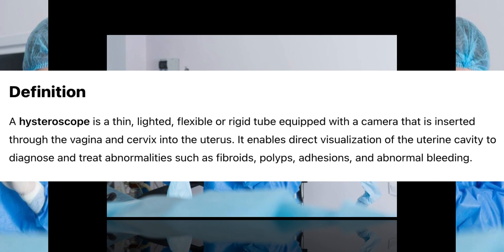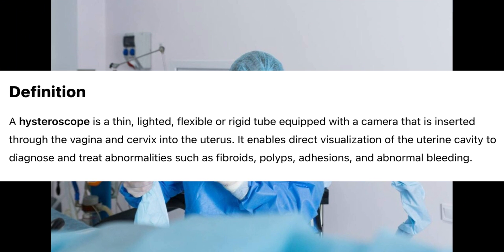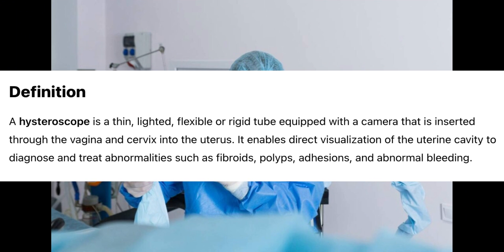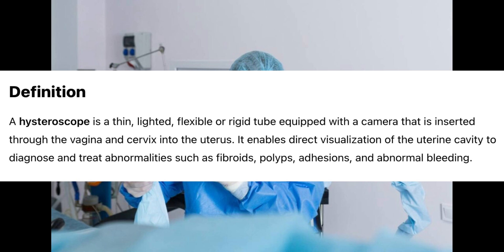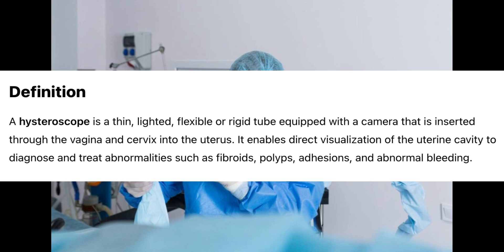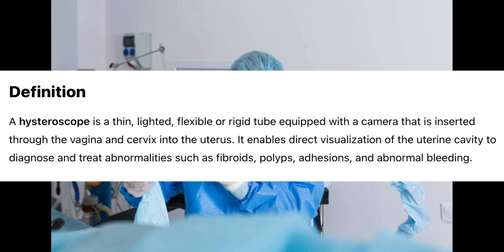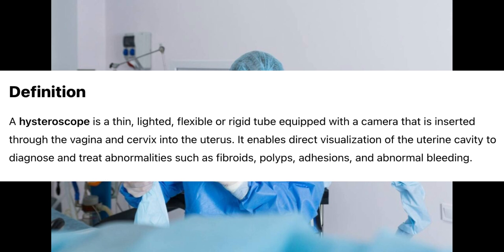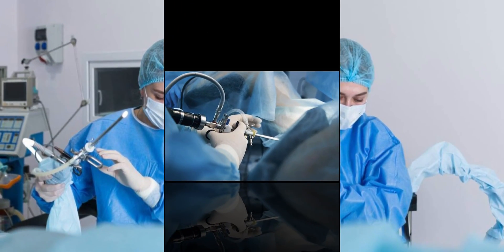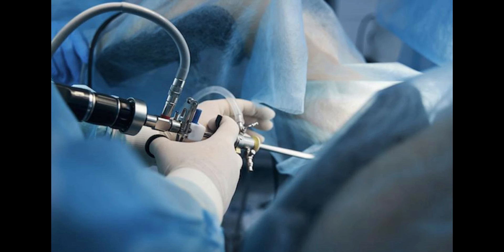Definition. A hysteroscope is a thin, lighted, flexible or rigid tube equipped with a camera that is inserted through the vagina and cervix into the uterus. It enables direct visualization of the uterine cavity to diagnose and treat abnormalities such as fibroids, polyps, adhesions, and abnormal bleeding.